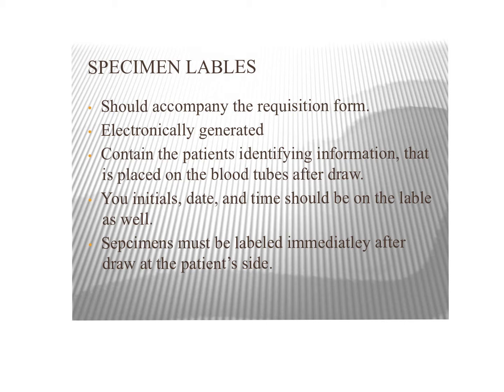And then we need to make sure that the specimens are labeled immediately after we draw, right at the patient's bedside. Okay, that's really, really important, because we don't want to draw those blood tubes, carry them on our cart, go to another patient's room, draw their blood, and then now we're like, oh, I didn't label them, so which blood goes to which patient? That can cause a lot of issues.